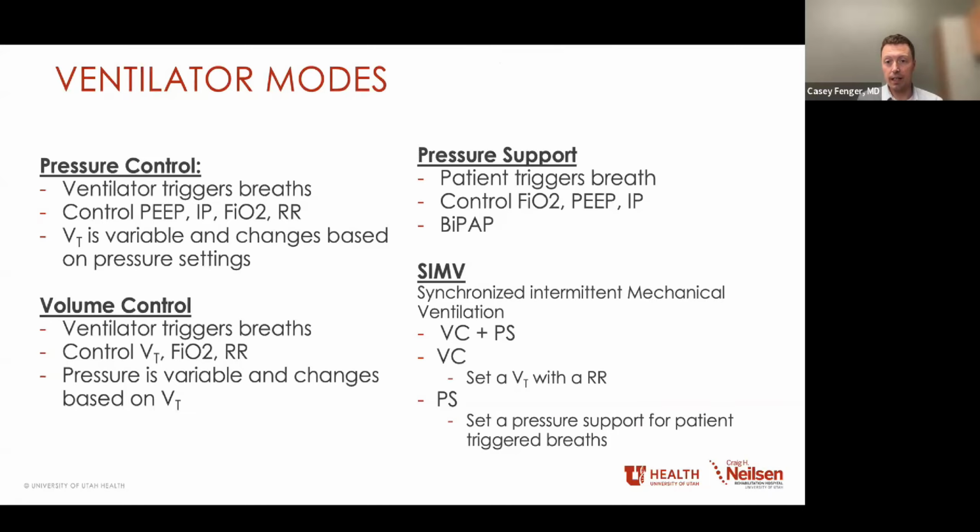This next setting, SIMV, which is short for synchronized intermittent mechanical ventilation, is a setting that we use quite a bit on rehab. And it's a combination of volume control and pressure support. So how it works is you set a volume control setting. So you're setting a volume with the respiratory rate that you want to ensure that the patient gets. And so regardless if the patient's triggering a breath or not, they're going to get that many breaths per minute of a set tidal volume.